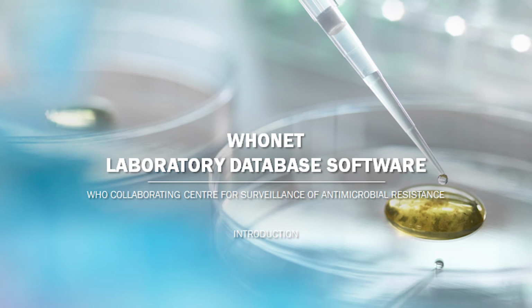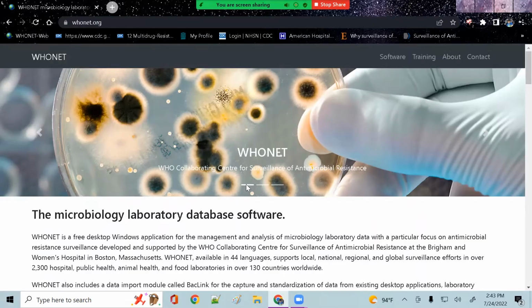Welcome to the WHONET introduction tutorial. In this video, I'll show you how to find our website, download our software, and install it to your desktop.